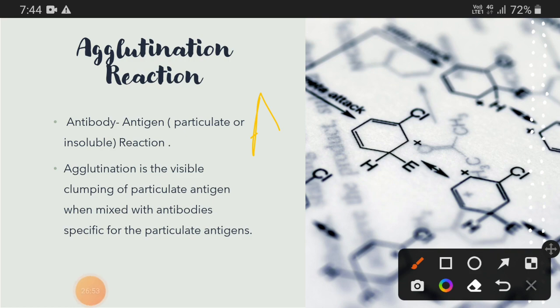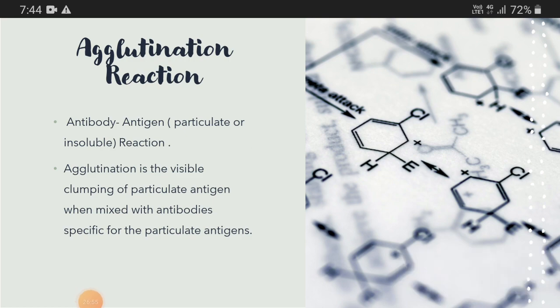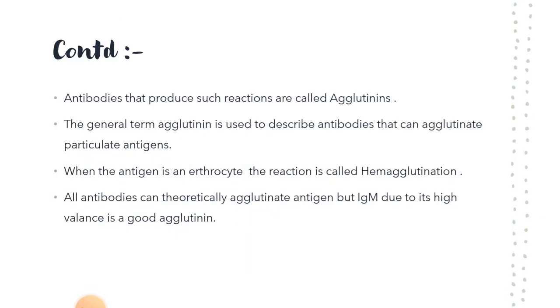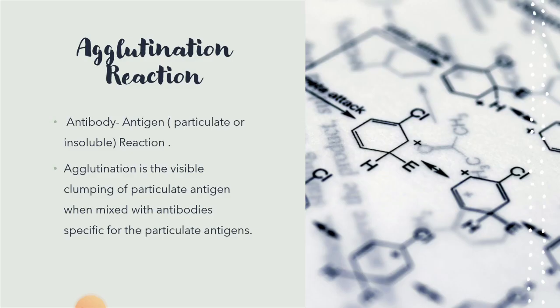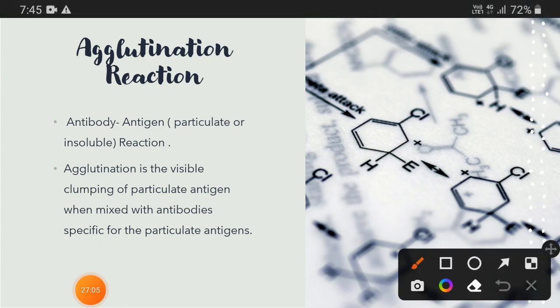The Coombs test can be divided into two parts: direct Coombs test and indirect Coombs test. In the direct Coombs test, remember, the antibody is already present on the surface of the erythrocyte. So here anti-immunoglobulin is added to erythrocytes suspected of having antibodies attached to their respective epitopes.